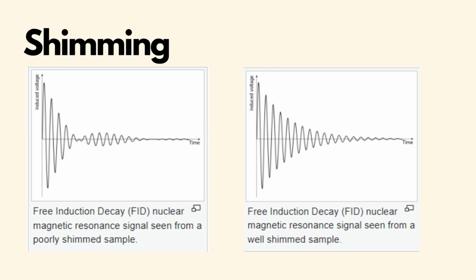Inhomogeneities distort the spatial encoding, which in turn adversely affects the slice geometry. The MR image will show distortions in the slice plane. In order to prevent this type of image error, the magnet system has to be adjusted during system installation to local conditions or deviations in unit spread prevailing in the unit. A process called shimming is used.